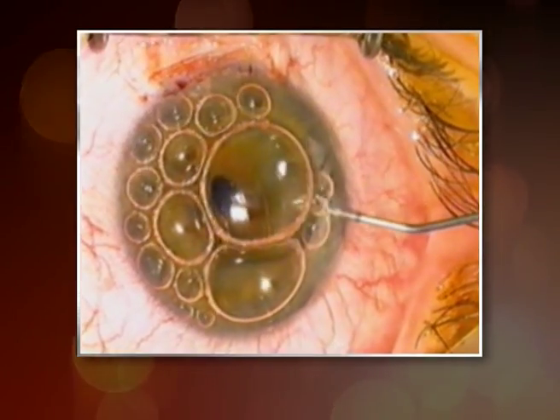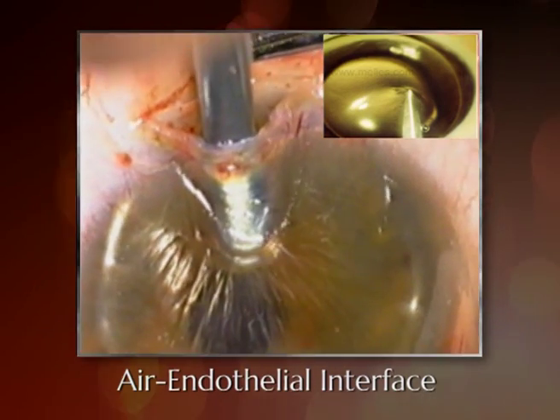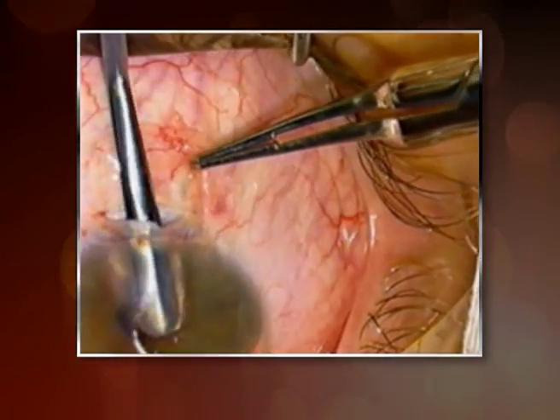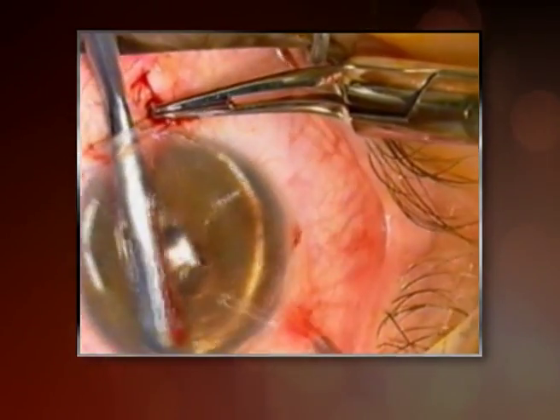The limitations of Melles' technique include the use of a slightly complex method of air endothelial interface as a mirror to create an optimal depth of dissection, and a greater risk of intraoperative perforation due to the closed method of lamellar dissection, where the dissection is not performed under visualization.